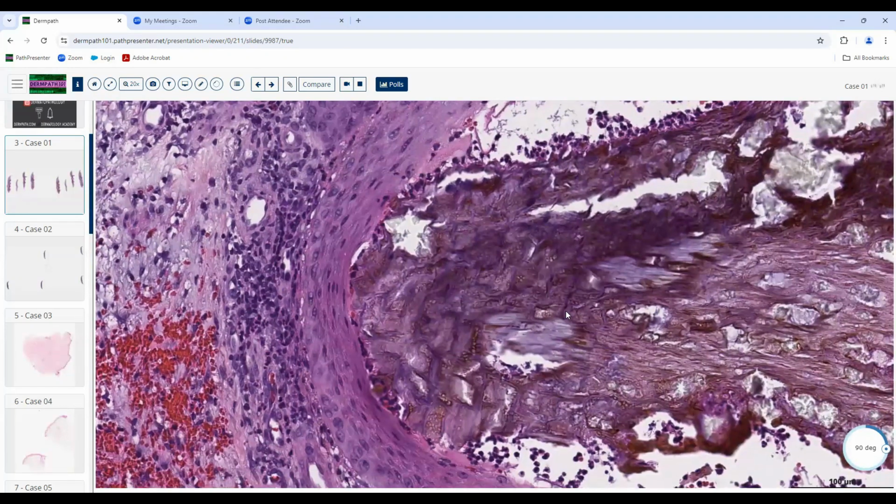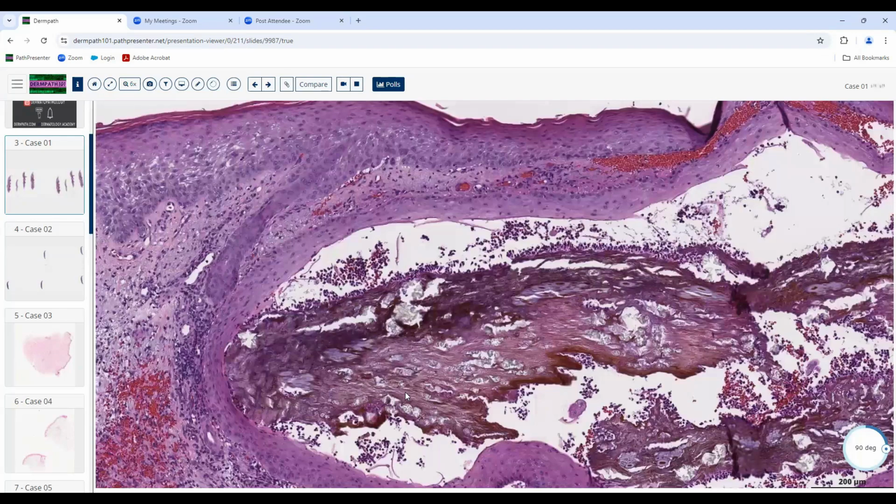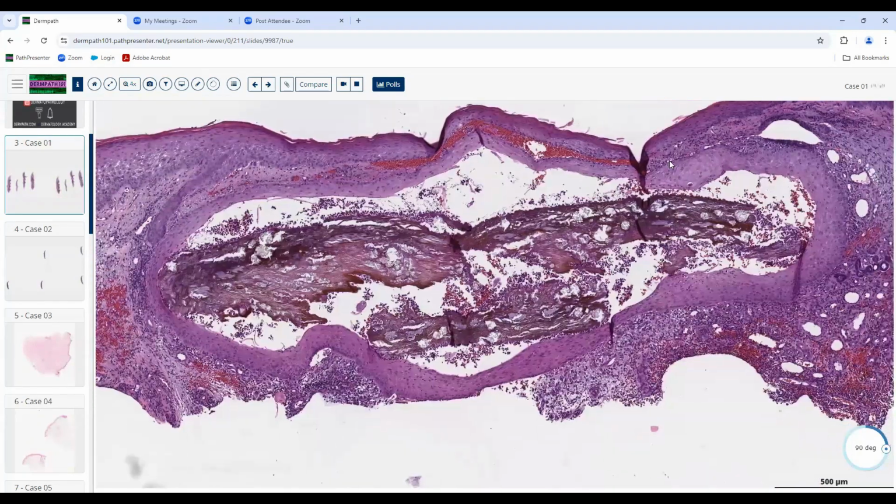It does not mean that the person's got the disease if the fungal organisms are living in the splinter. This is just sitting, he doesn't have any real inflammation around this. The host, as you can see here, has formed a nice little wall around the organism, or well, around the splinter, and is trying to transepidermally eliminate it through the epidermis. It really hasn't happened yet, so it's formed a little cyst.